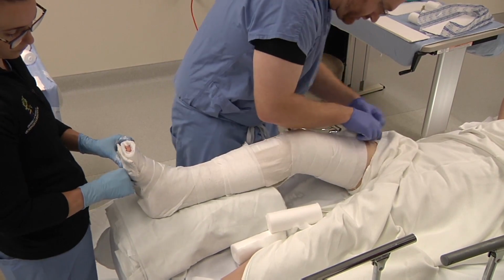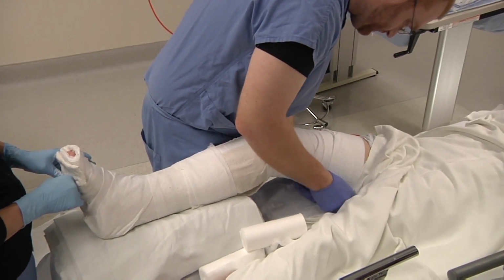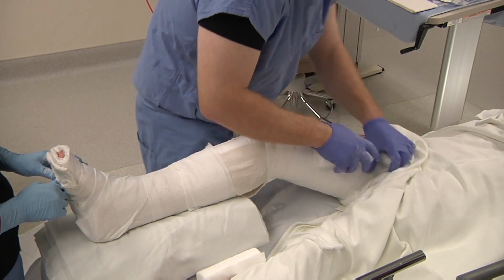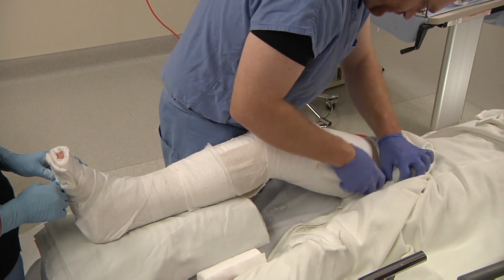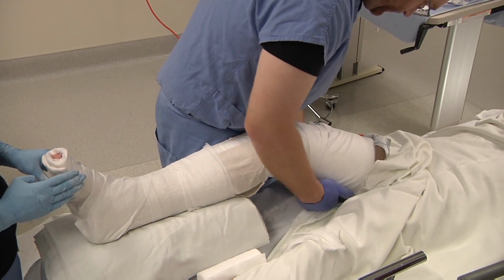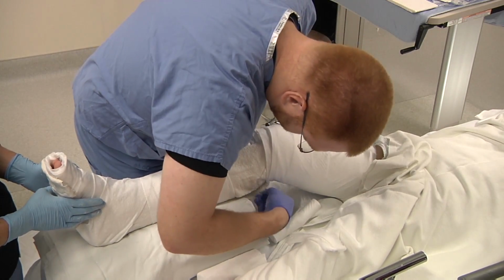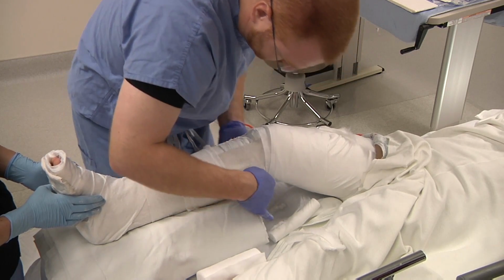Generally on the long leg extension, you want to go as high as you can so that you are getting that rotational stability. Up on the thigh, it's sometimes easier to use the bigger 6-inch web roll. It's always good if you can get the web roll a little bit higher than where you're going to put your plaster as well, so you can turn it down to avoid any pressure areas. Popliteal crease is an area where the plaster can ride, so if that needs to be turned down, you can turn that down and debulk a little bit there if need be.